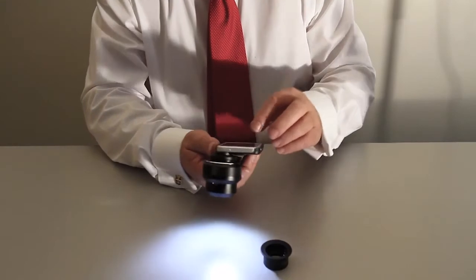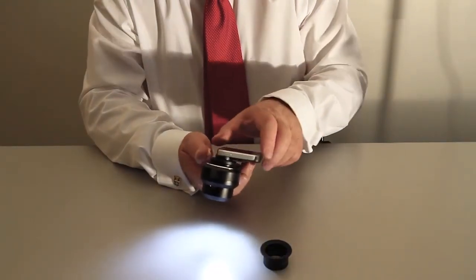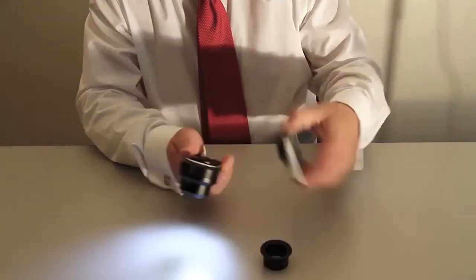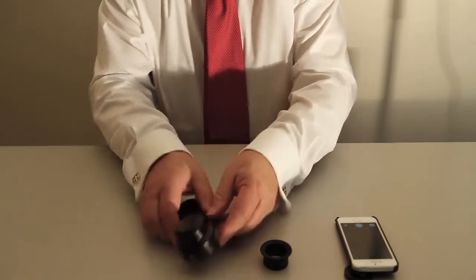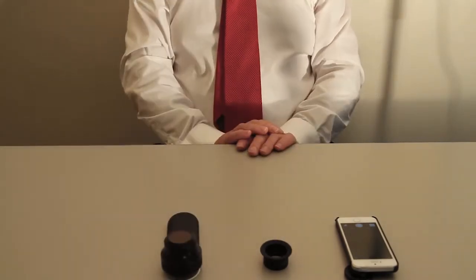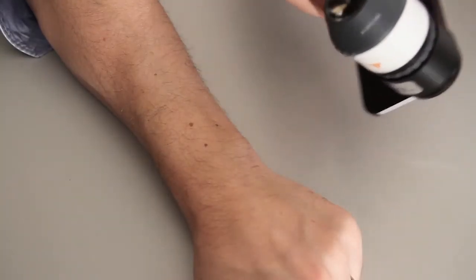And then in the same way, with contact with the patient, you can actually increase the image size so that it fills the screen. When you're finished, it just separates as easily as that, and there it is. So taking a photograph here, turn it on and add a nice generous blob of the interface gel.